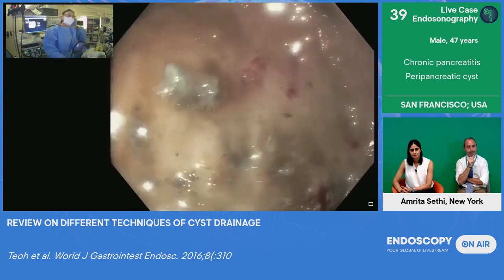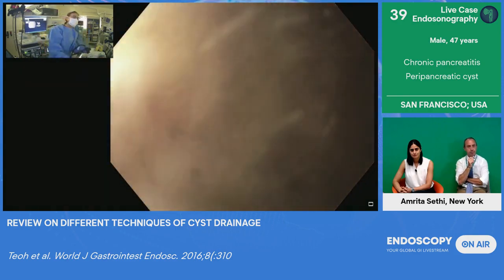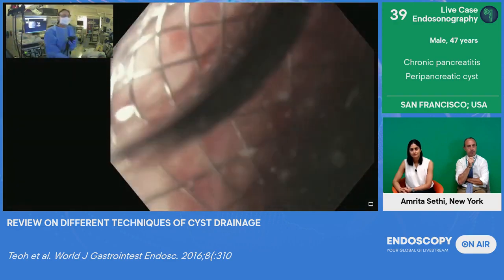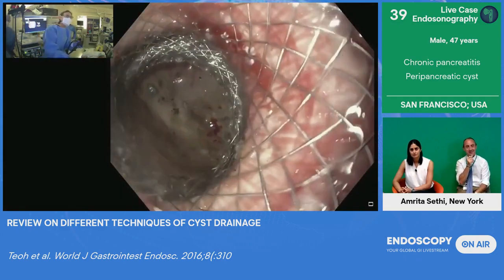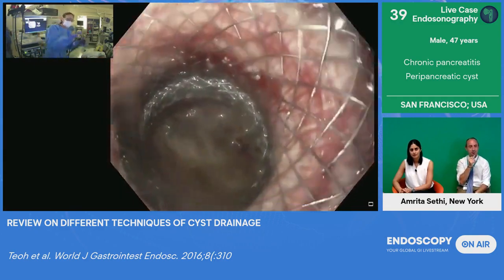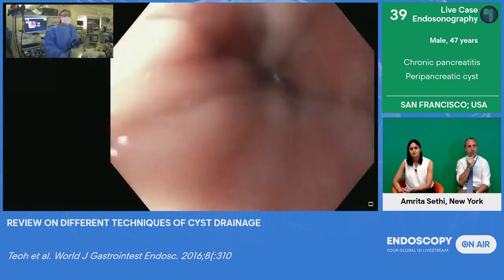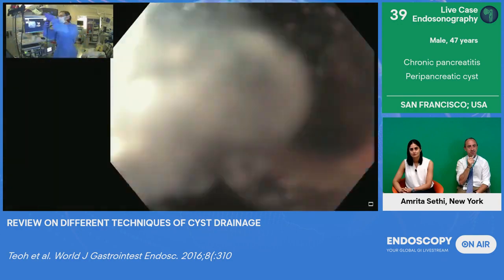So you can see here with the water, you don't want to infuse gas too aggressively in here. So you can do underwater cystoscopy and just to whet your appetite for the next case. But everything looks good. So I'm going to pull out now. Everything looks good. I can see that we're not seeing any pus, minimal debris. So, and I'm going to go to the other room, and I'll see you in a couple minutes again.